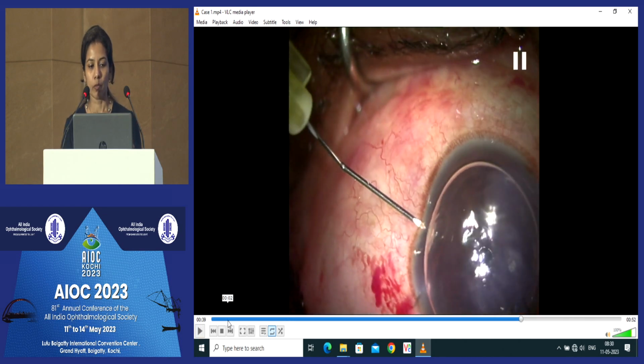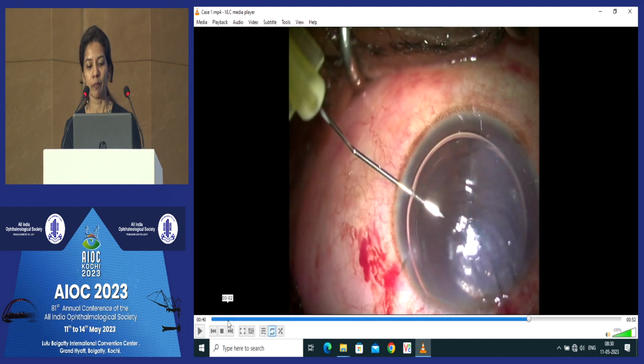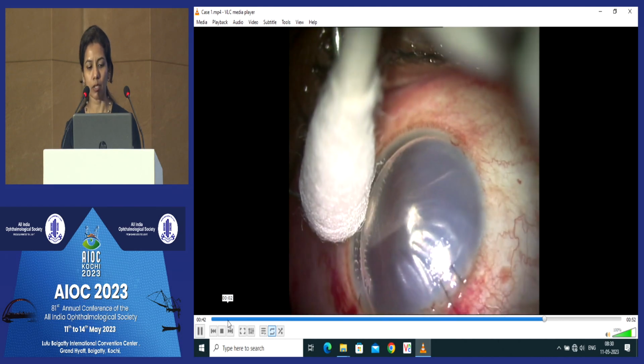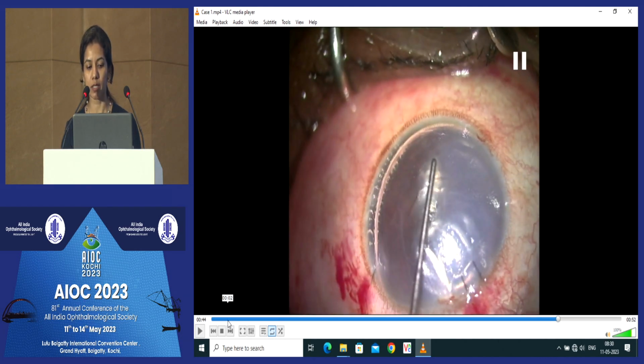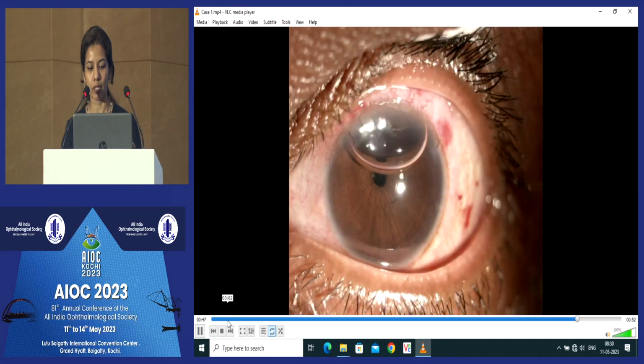So I go in with a 30 gauge needle and a 2 cc syringe, with the cannula facing away from the direction of the DMD. We enter a little at the limbus, making sure you don't strip the DM at that position again. And you use a bud as you retract outside so that the air doesn't escape through your entry wound. And finally, I egress the fluid out a little more, and that is her post-op day 1 picture.